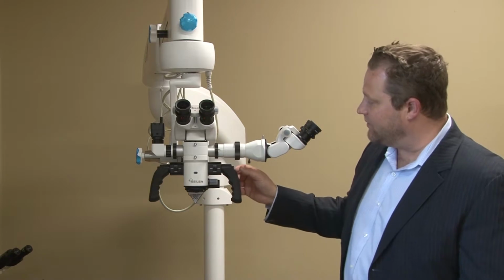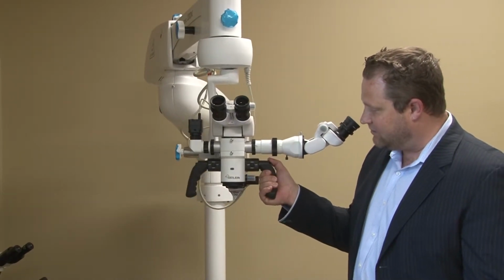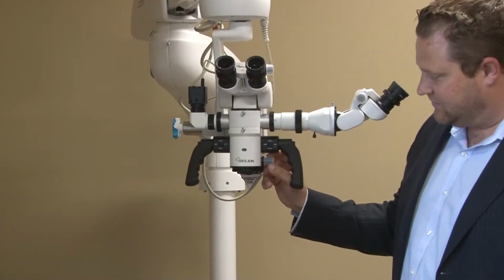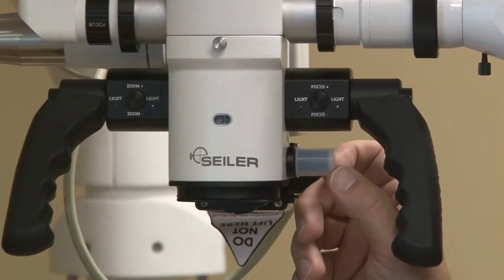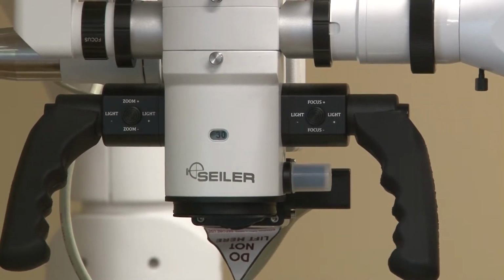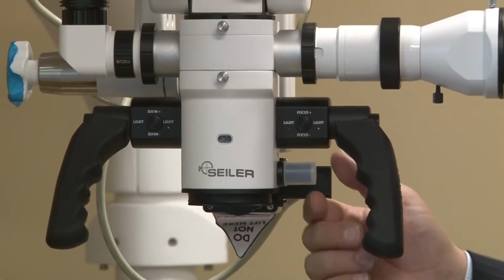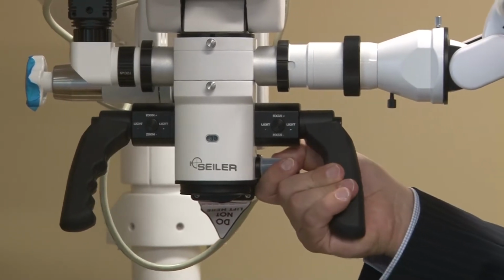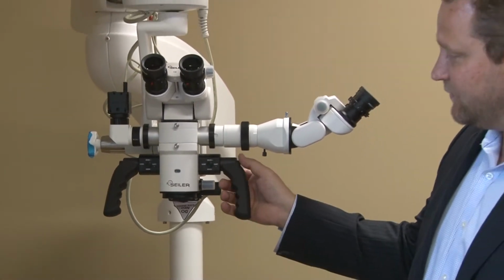And this is what really makes the microscope for ophthalmology for the cataract surgery. So this is called the red reflex, and all you do is rotate the knob, and what that's going to do is make the cataract really pronounced so that the ophthalmology will be able to... we have a very rich and contrasted red reflex, so the doctor will be able to perform the essential function very easily.